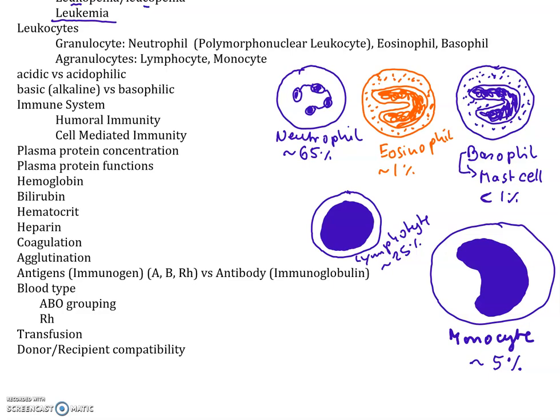They will try to fight pinworms, for example. Basophils, you have very few of them in circulation because almost immediately after manufacturing them, they will be migrating into tissues where they're then called mast cells. Their granules like a basic dye, and therefore you offer them one to stain the granules. So they stain with crystal violet, which is a deep purple kind of dye. And you can see the nucleus and the granules showing up in a very dark purple color. Again, when they are in the tissues, they're called mast cells.